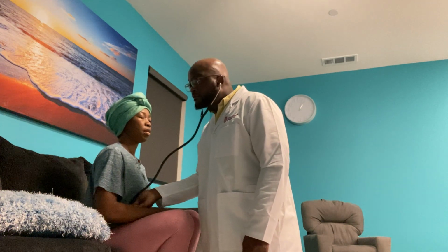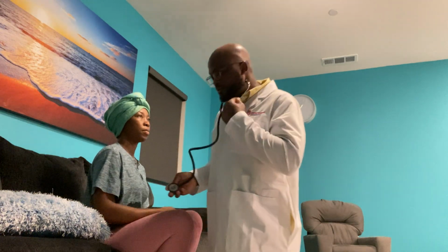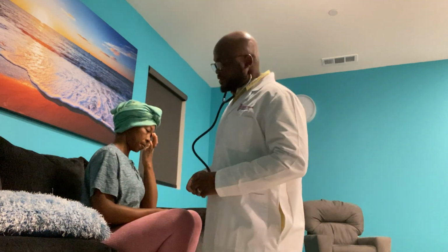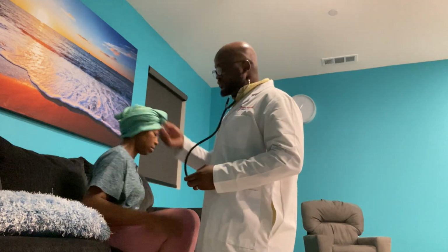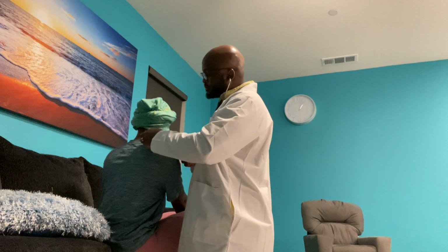Okay, so we'll do the egophony on the posterior now. Say E, once I move my scope.